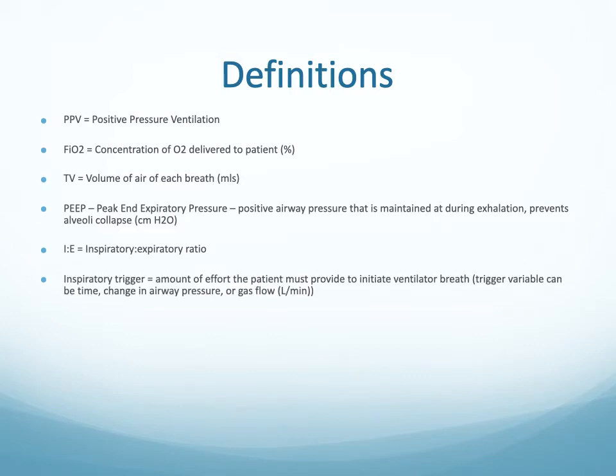Inspiratory trigger. Now, a trigger is a variable that is used to trigger the machine to breathe for the patient.